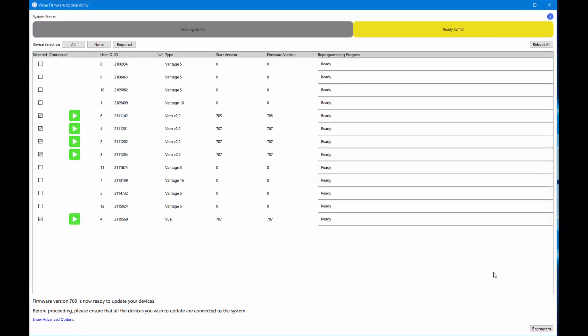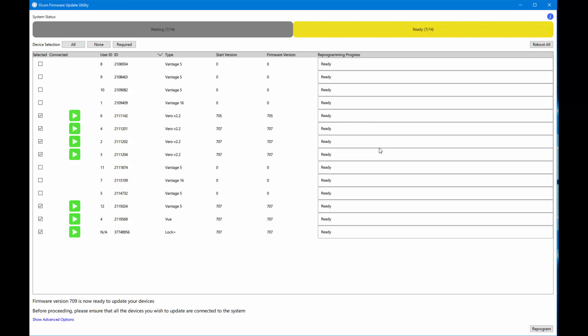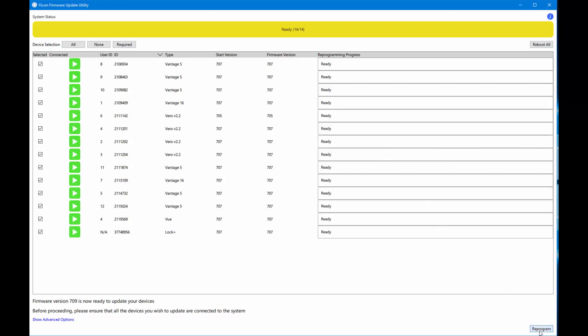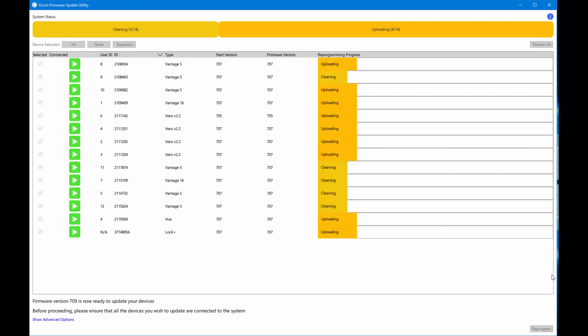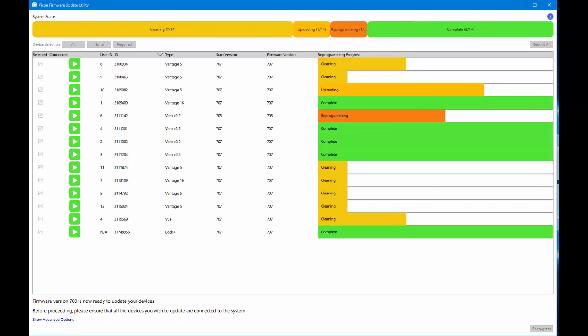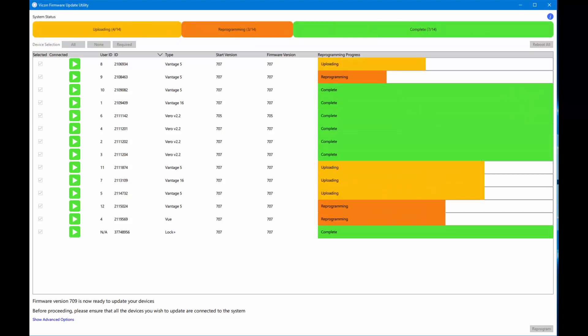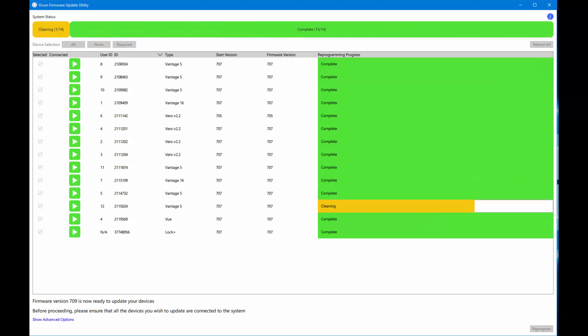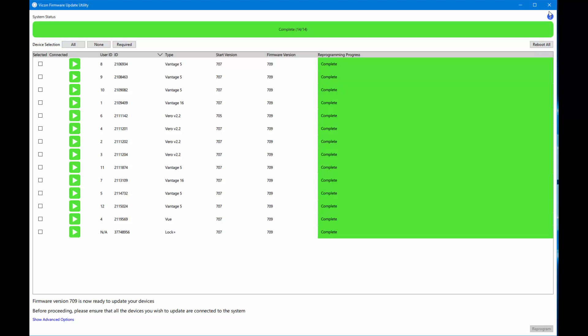When the reprogramming tool opens, it will show all connected devices and the current firmware version. By default, all devices will be checked to be reprogrammed. Click Reprogram to begin the reprogramming process. When the update is complete, the Firmware Version column displays the updated firmware version. When you close the firmware reprogramming tool, Nexus 2.8 will reopen.